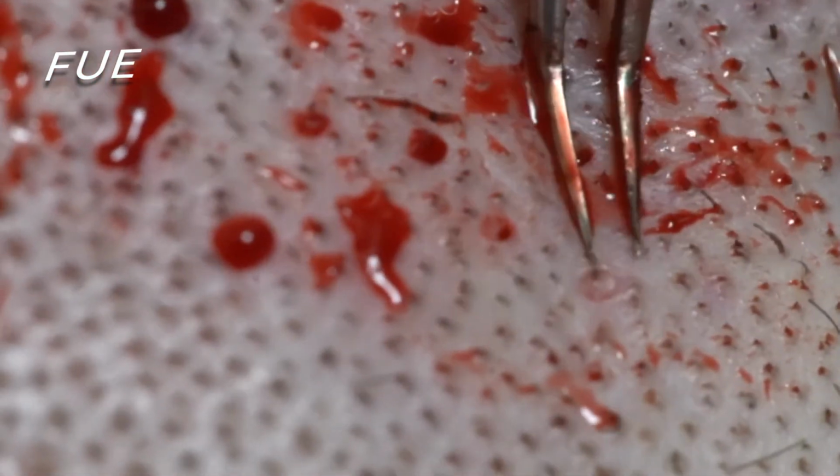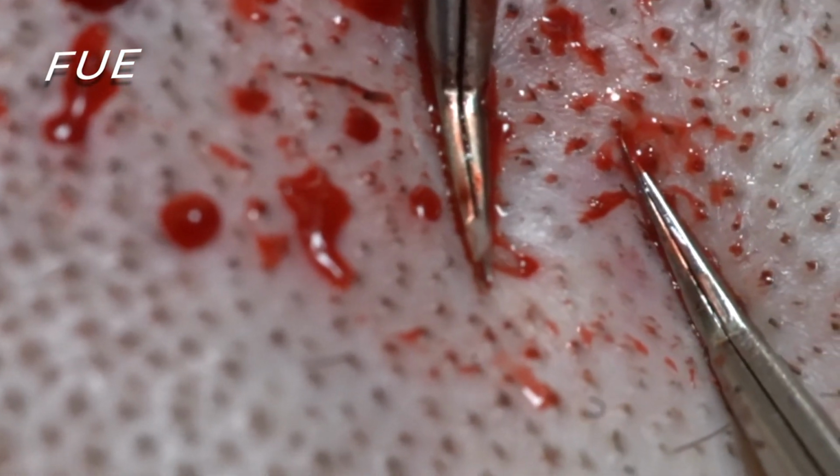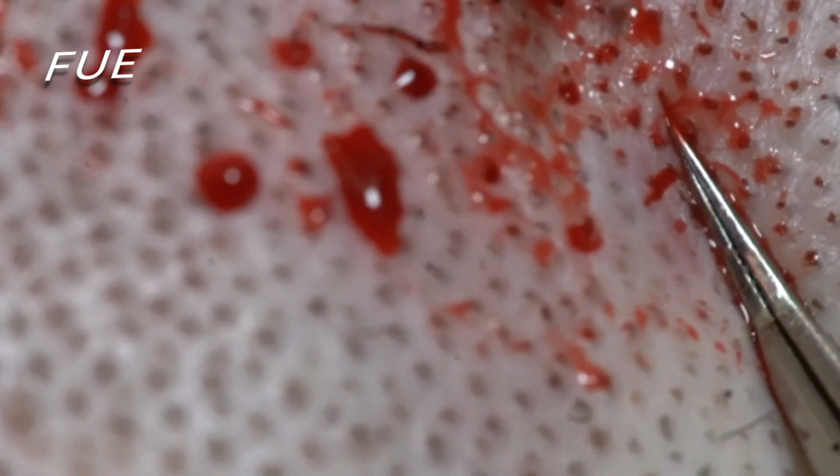All right, this one's looking good. This is coming out. We're pulling. It looks like it needs a little bit more tension. It just tore, and we're trying to get that graft out, and we just can't.